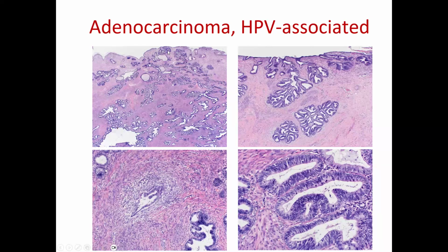Why? Because we know that the gynecologist is looking for the 3 millimeter. So this lesion is grossly more than 3 millimeters. It doesn't matter if you start measuring from here or from here. This is going to be like 1 centimeter. So we don't need to fight about measuring from here or from there.